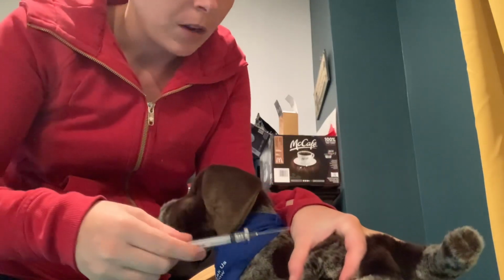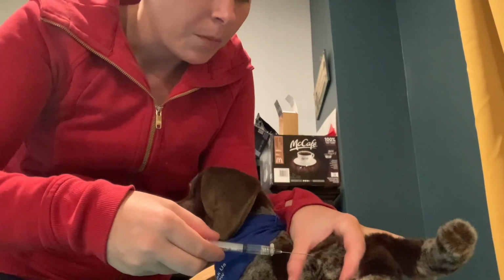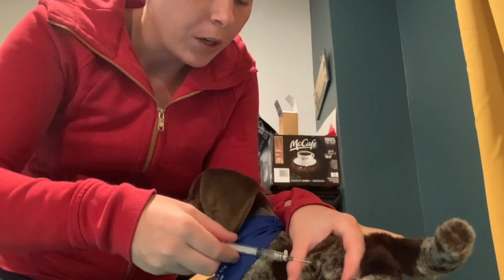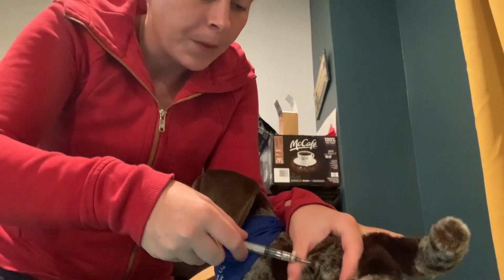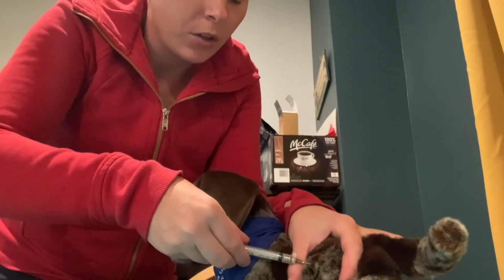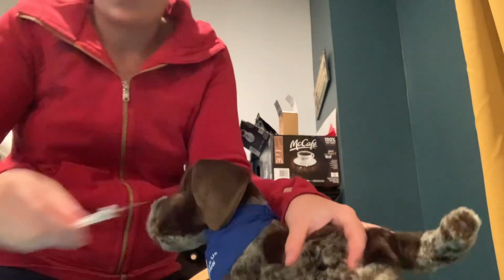I want to make sure again my bevel is up. Okay, my bevel is up, my site is prepped. So then I can go in. We don't want to be going in very deep here. We don't need to be going in very deep here. We'll be drawing back again. And then moving forward because there is no flash. So I am in the muscle, but I am very superficial there, which is just fine. That can be a little bit of a safety factor for this animal as well.